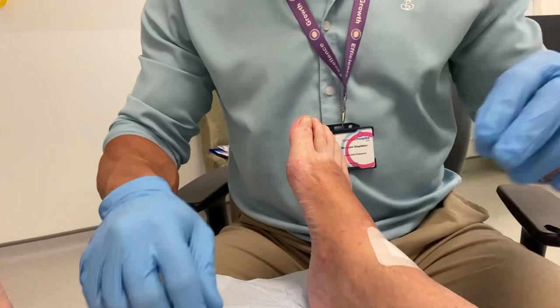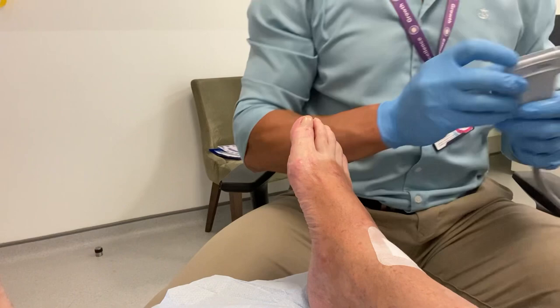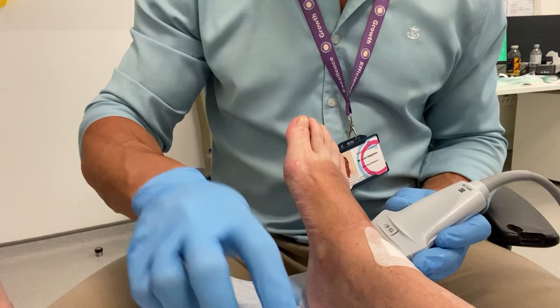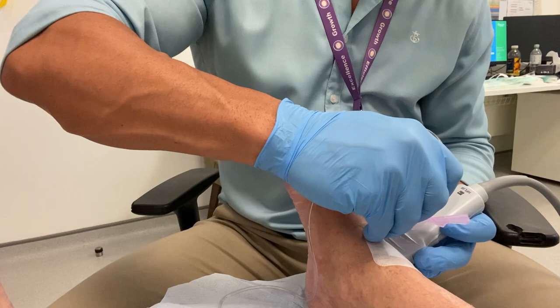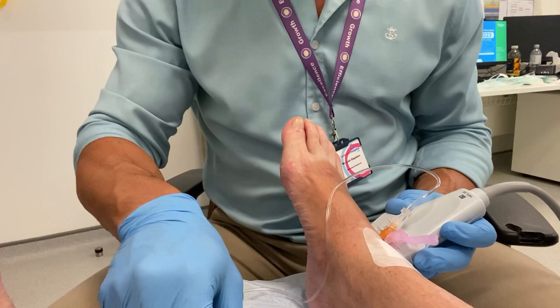I have a fresh line and fresh syringes. Antiseptic is applied before and between each procedure. You have to remember with these lines to fill the line before you begin the injection — the line is filled with local anesthetic, so we have about a mil or a mil and a half of anesthetic injected first. It certainly makes the injection more comfortable.